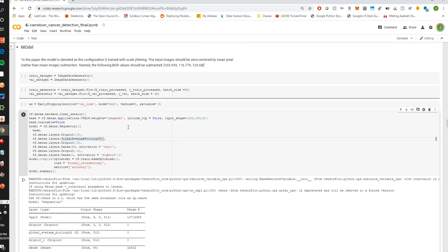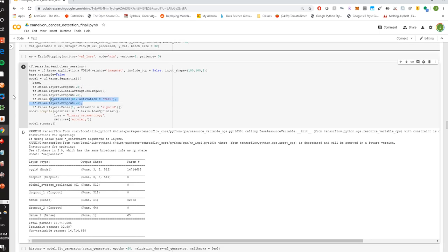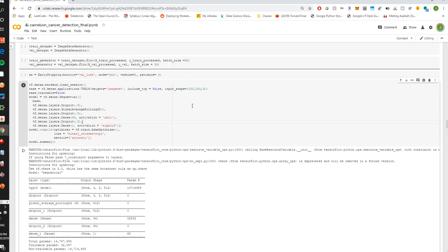So here's our first model. This is the zoom level 3 model, right? We have a lot of dropout layers to help prevent overfitting. We have the VGG architecture base, some dense layers, and then finally a prediction layer. We have to specify the input shape, and we're using 100 by 100 images.